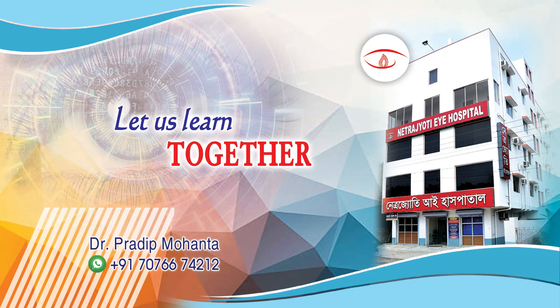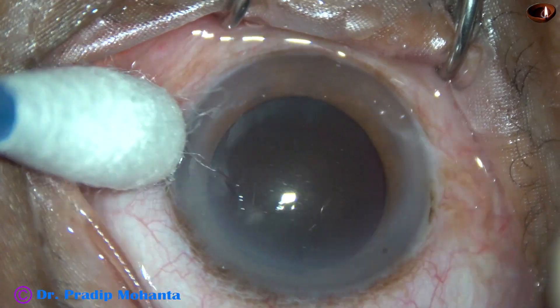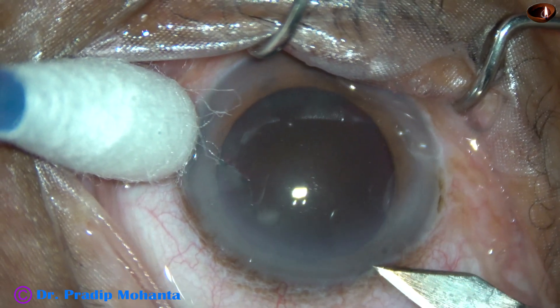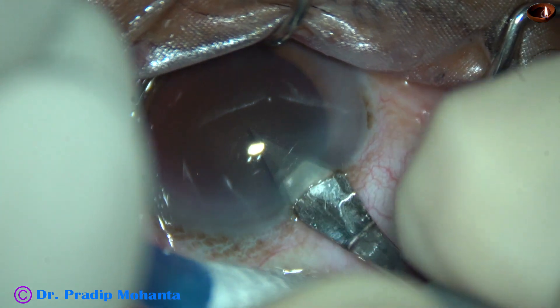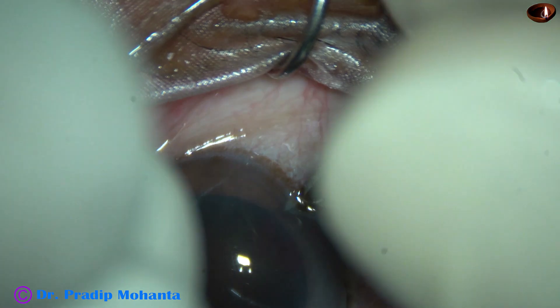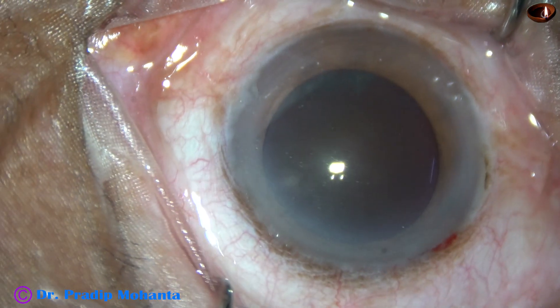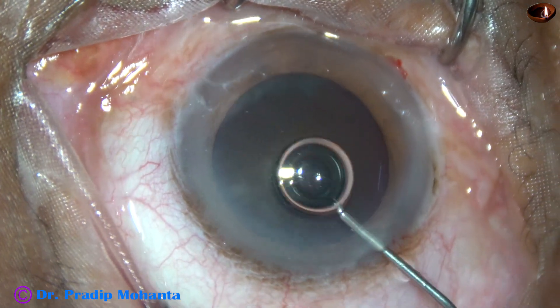Friends, welcome to my workplace at Ranaghat, West Bengal, India. This is a very hard cataract. I thought of doing small incision cataract surgery for this case, but at the last moment I decided to do phacoemulsification for this very hard cataract. Nuclear sclerosis in this case is about grade 6.